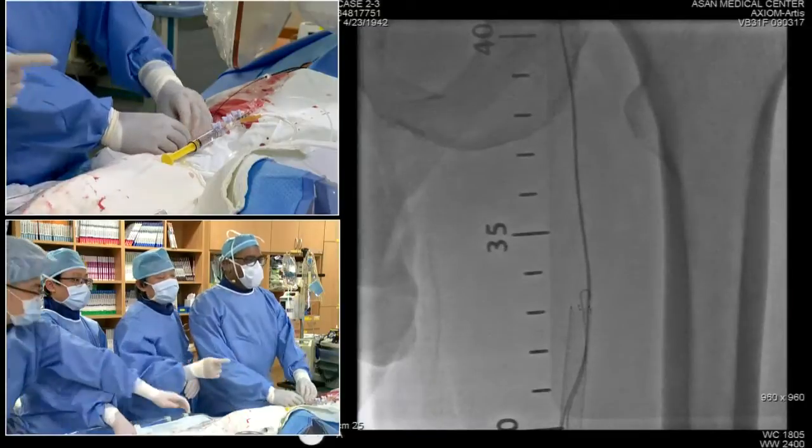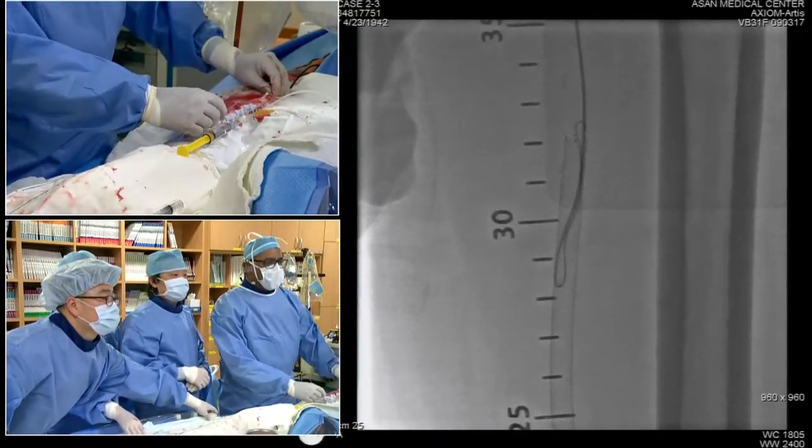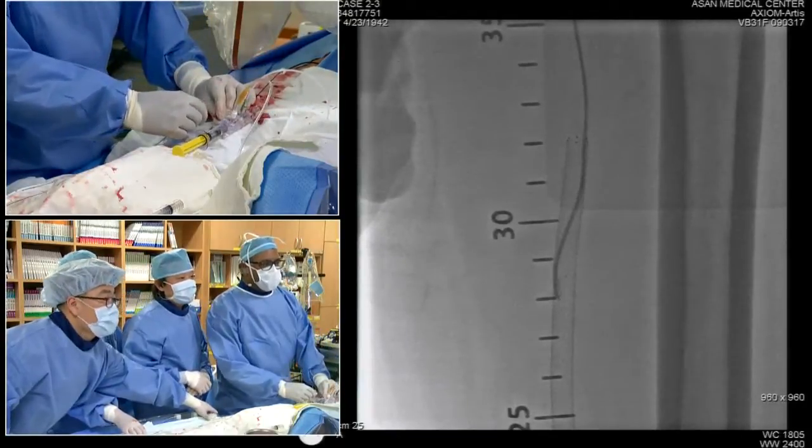That was a slick move. That needs a congratulations. I think we are in the stent. We are not alongside the stent. What do you think?